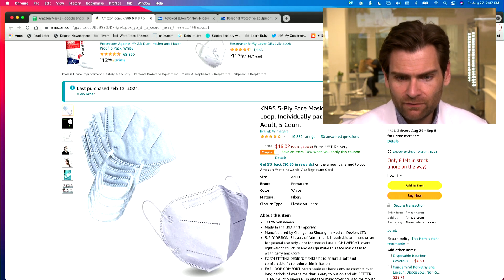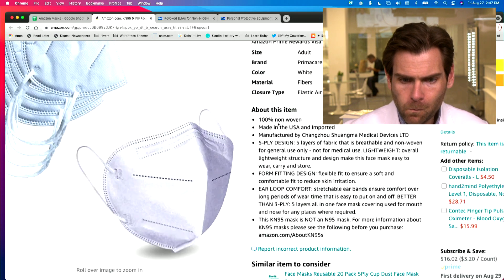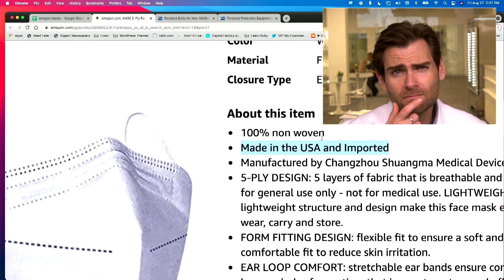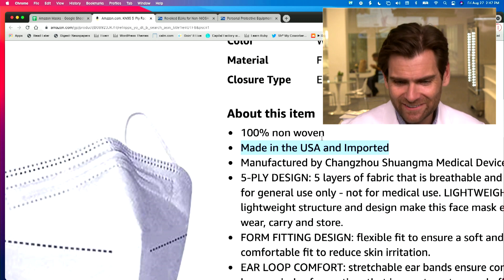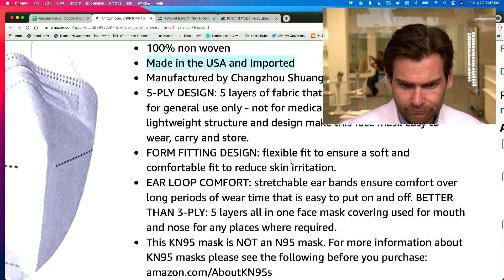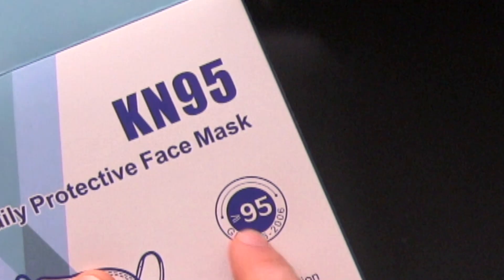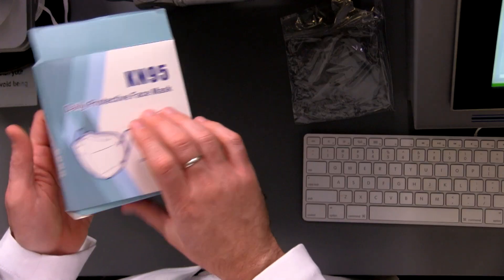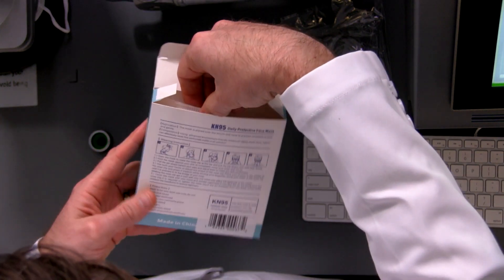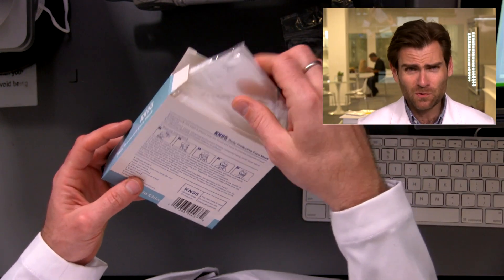We bought this on Amazon — KN95 five-ply mask, made in the USA... or wait, this is very confusing: 'made in the USA and imported.' Manufactured by Changzhou Shuangma Medical Devices Ltd. On the box it says GB2626-2006, which is the KN95 standard. And then further down it says made in China — so not made in the US. I think that was a typo.